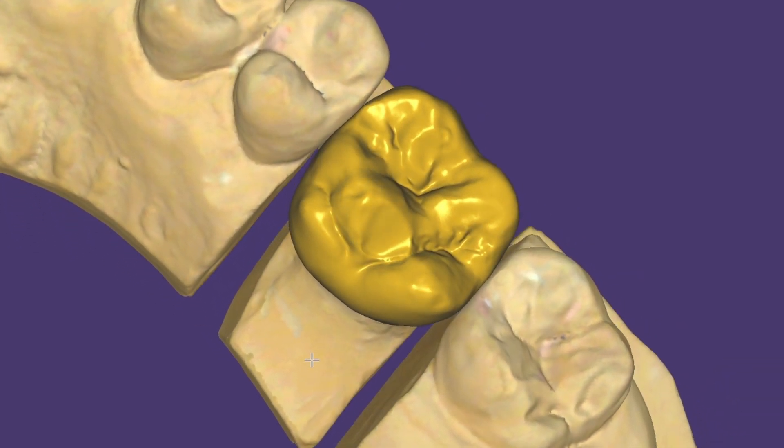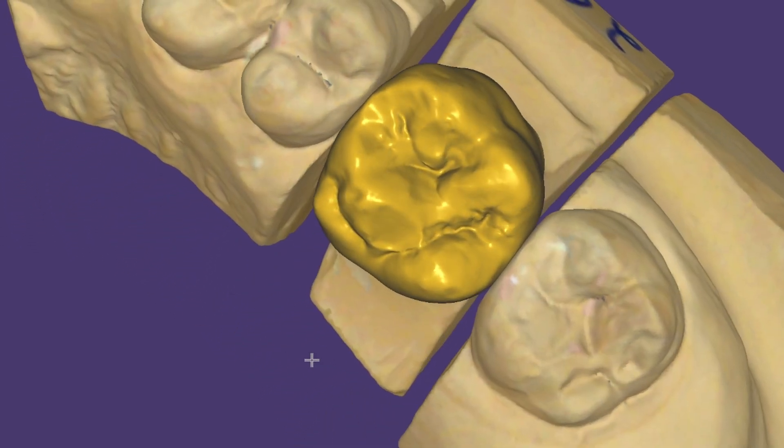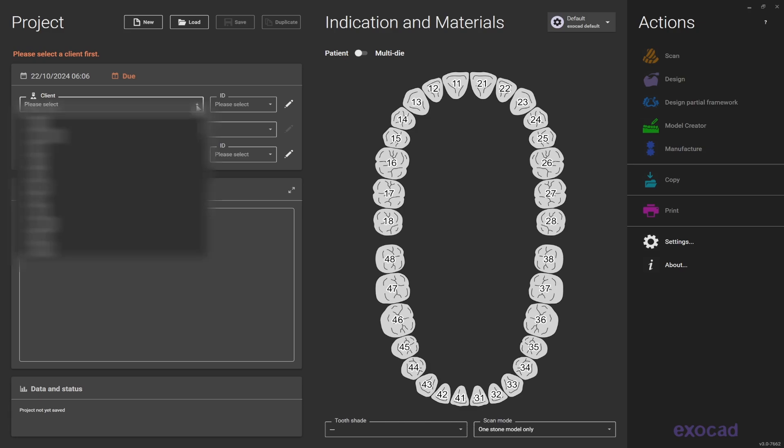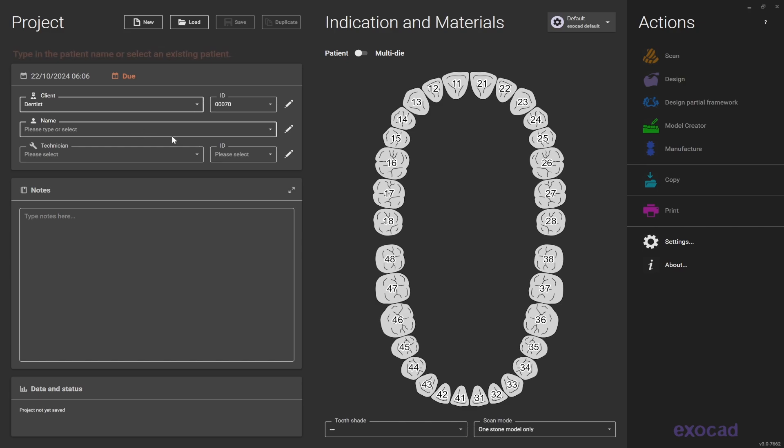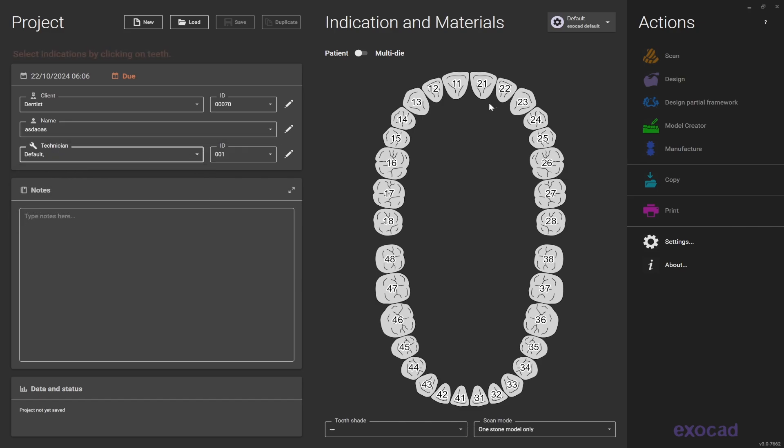Today we are going to learn how to do a single posterior crown on ExoCad. Begin by starting a new project and filling up these fields. Select the name of the dentist, write down the patient's name, and select the technician's name.